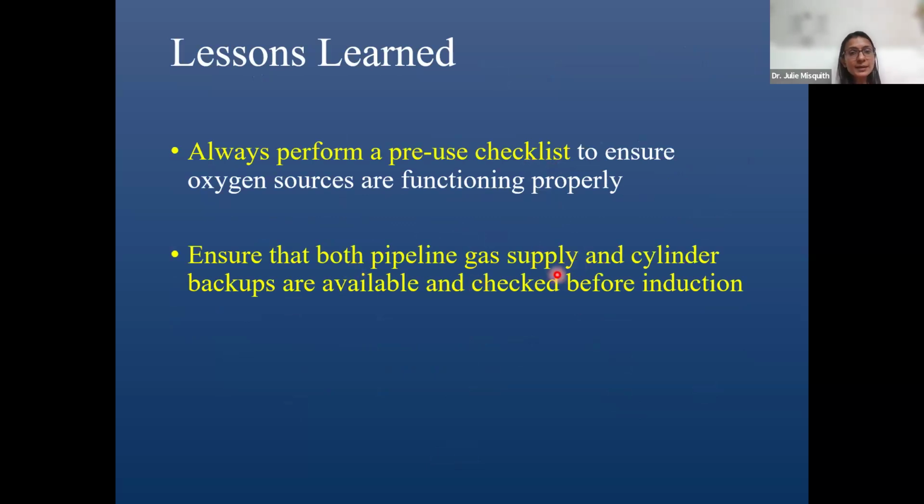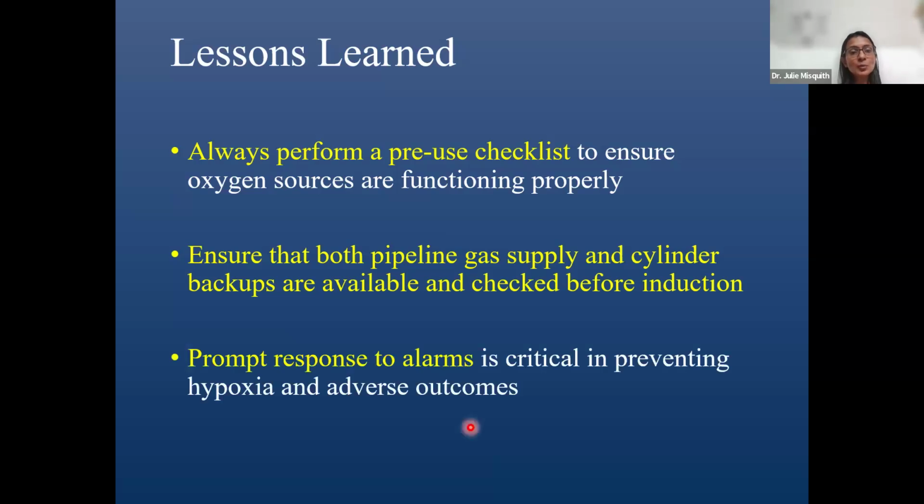Ensure that both pipeline gas supply and your cylinder backups are available and checked before induction of the patient. And prompt response to alarms is critical in preventing hypoxia. We should not ignore alarms.